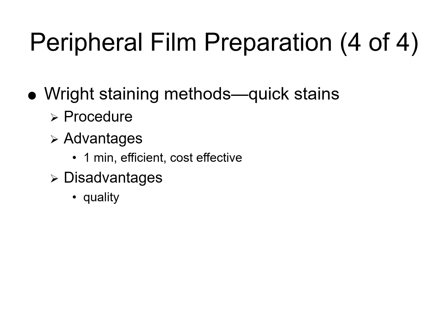There are also quick stains for the Wright staining method. Quick stains are modified Wright stains, designed for rapid staining of peripheral blood smears, and these are usually completed within about 1 minute versus the 10 to 15 minutes of the manual method. The procedure typically involves applying the stain to the slide, a brief incubation, and then rinsing and drying, which allows for a very fast turnaround time.